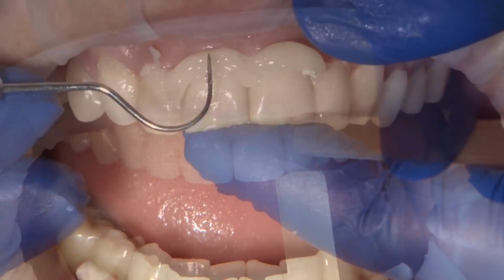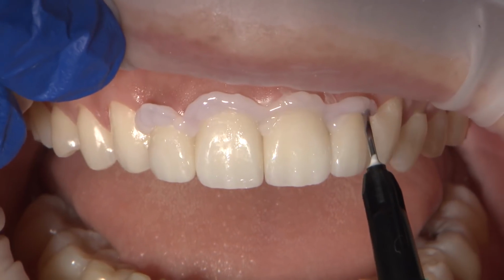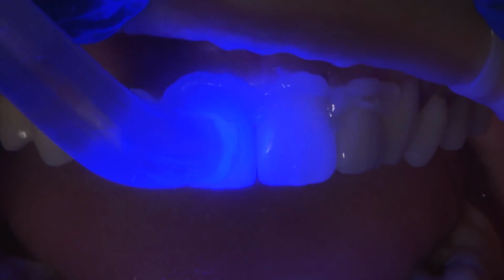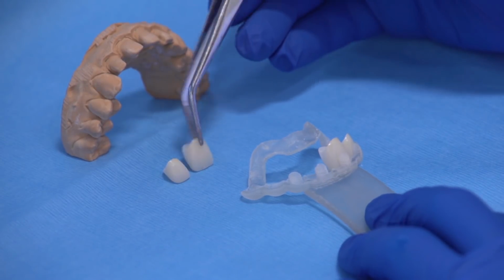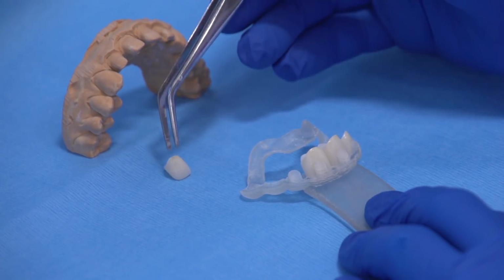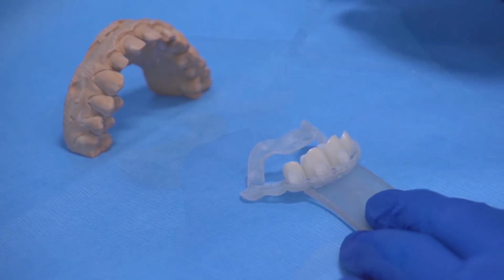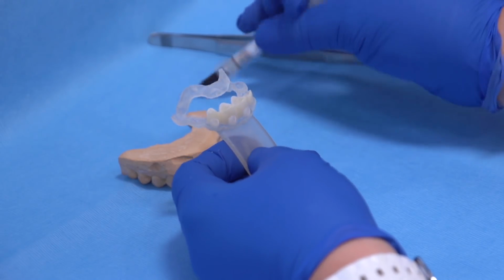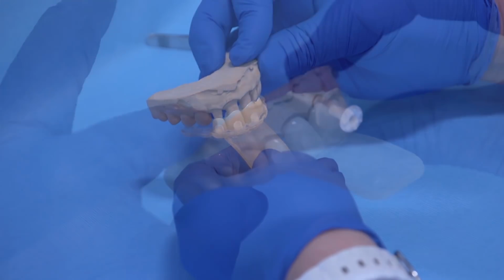After tack curing for 2 seconds, the excess cement is removed and a strip of glycerin gel is extruded and light cured once more to prevent the formation of an oxygen-inhibited layer. The same process could be achieved with a digitally fabricated tray, now being demonstrated on the model. The crowns or veneers can be safely nested into the correct position in this tray. Once the luting cement is loaded, all the restorations would be carried and safely seated in the mouth, as you can see seating it here on the model.